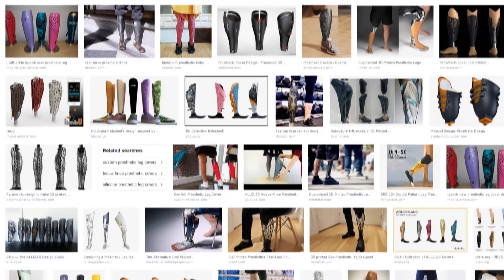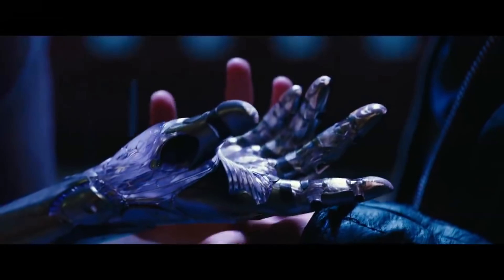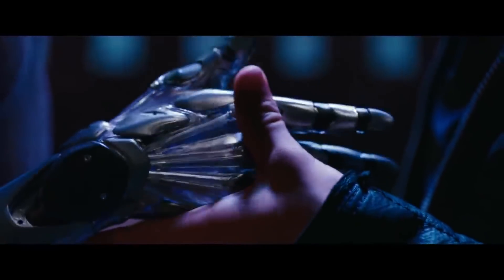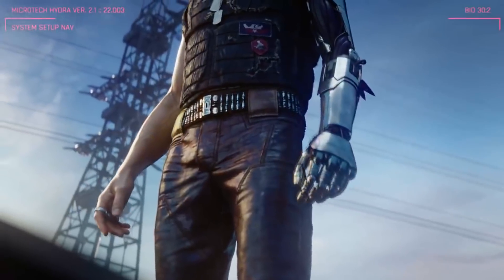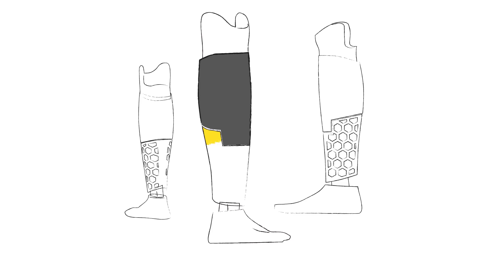There are a lot of cool prosthetic cover designs online, and we can also find awesome artwork in movies like Alita or video games like Cyberpunk 2077. But I wanted to create something original, something that matched as much as possible with Dominic's expectations. Dominic told me he wanted a black and yellow cover with a futuristic vibe, so I sketched a three-piece cover with hexagon cuts on the bottom part.